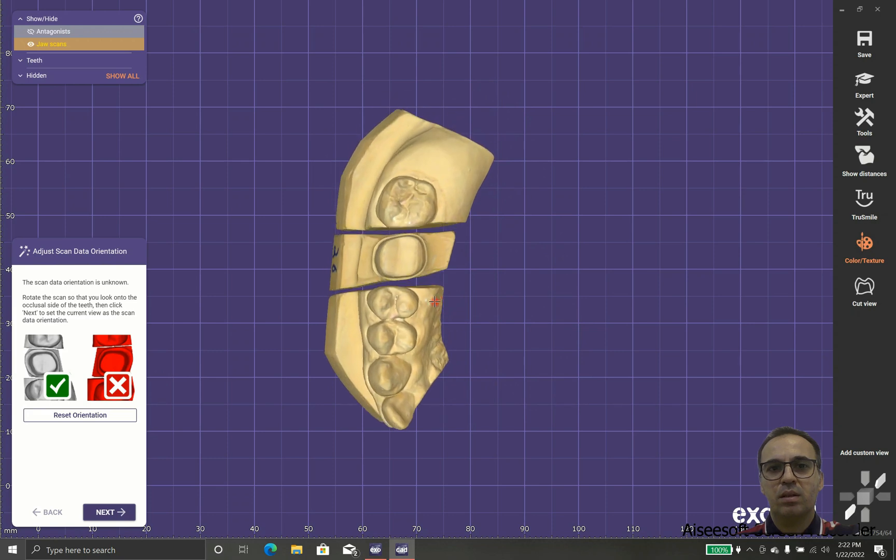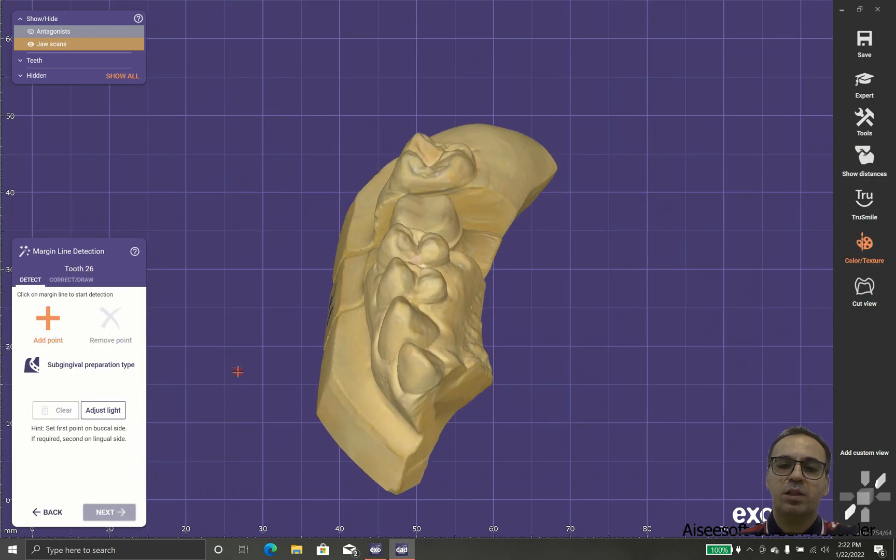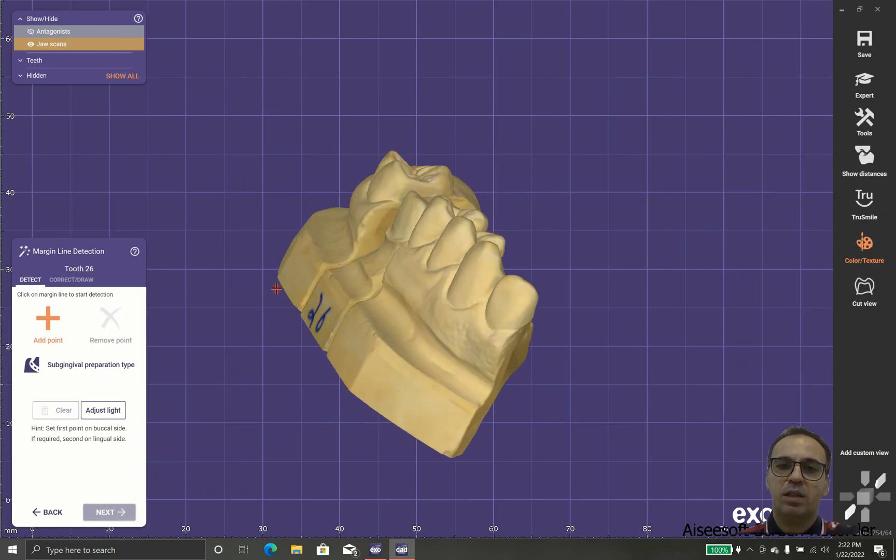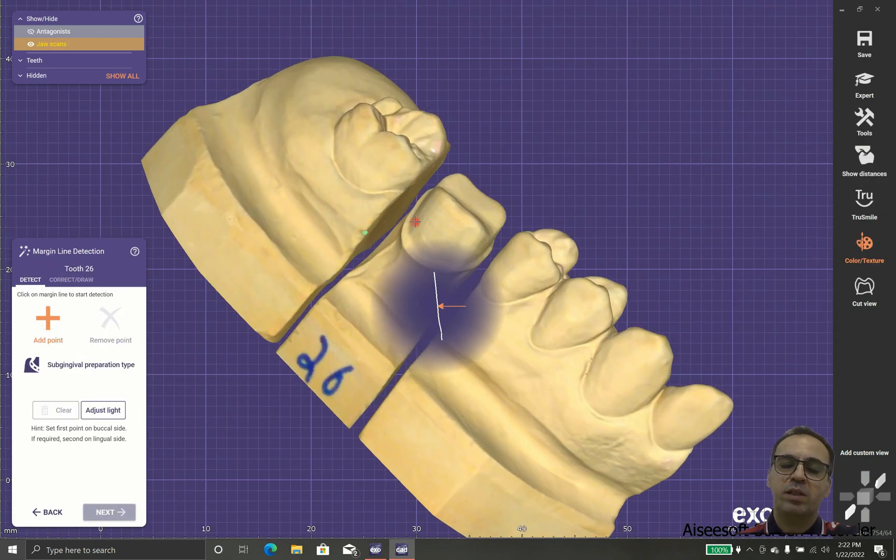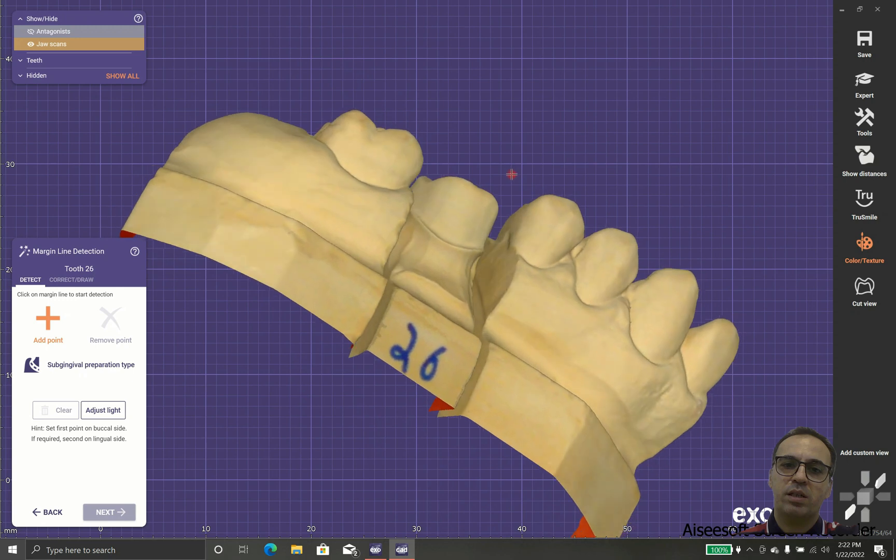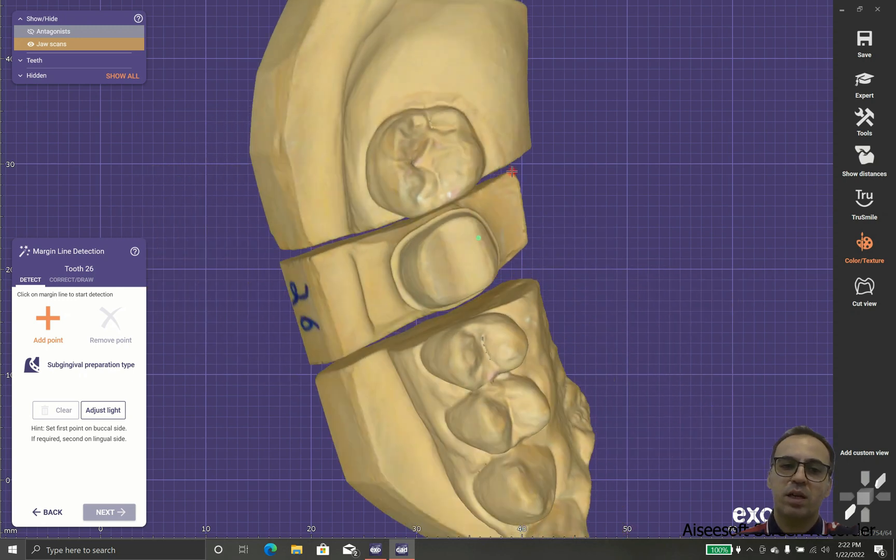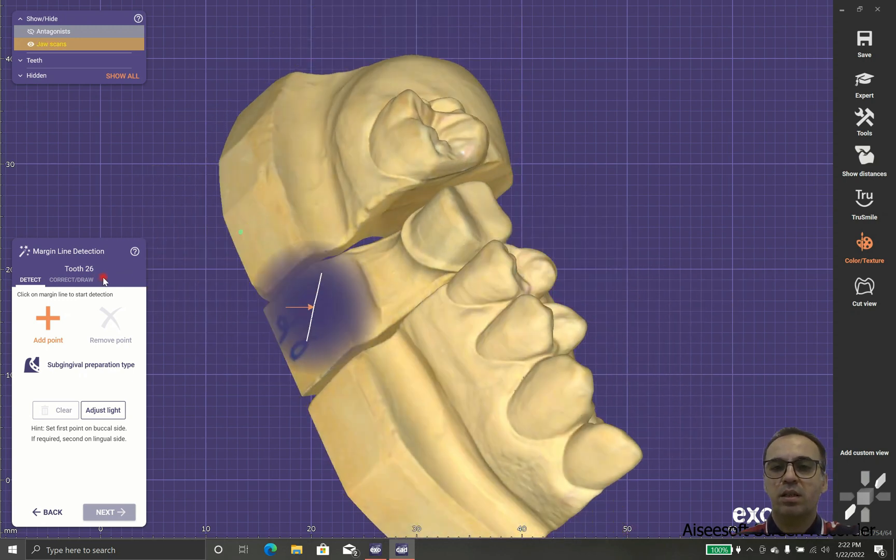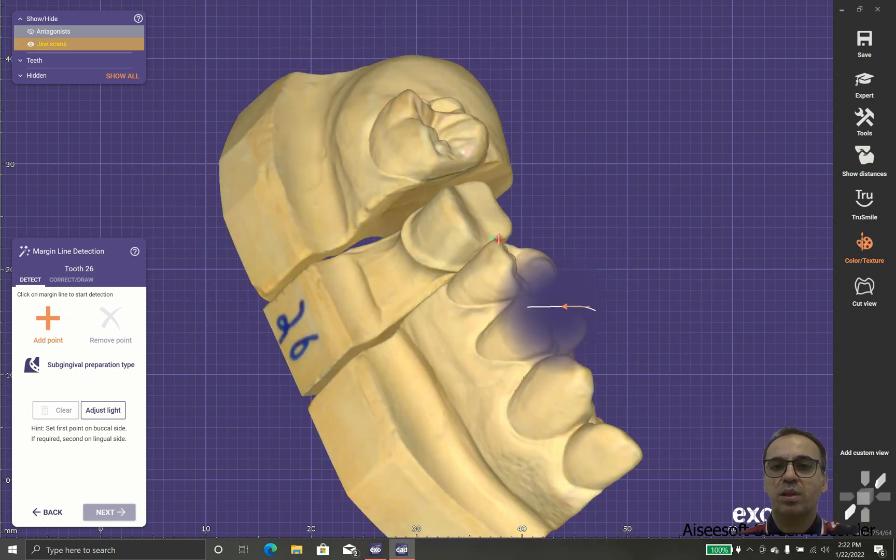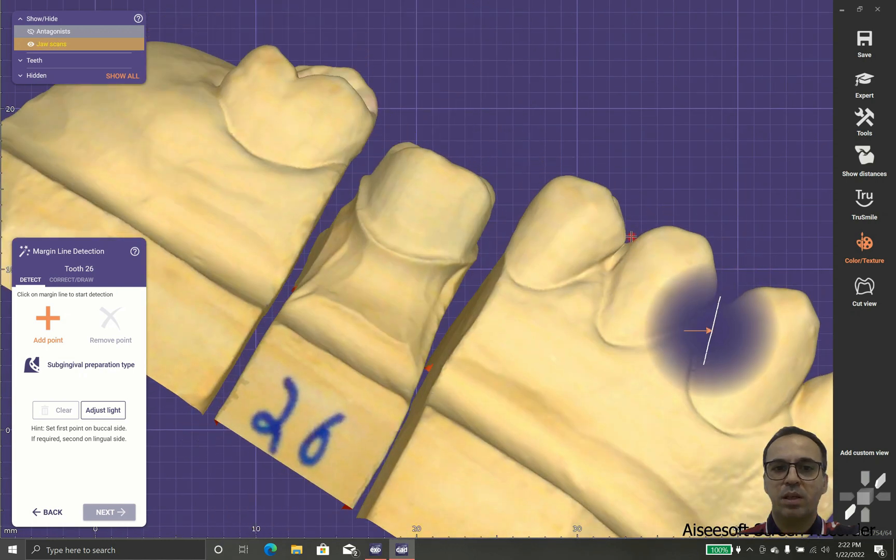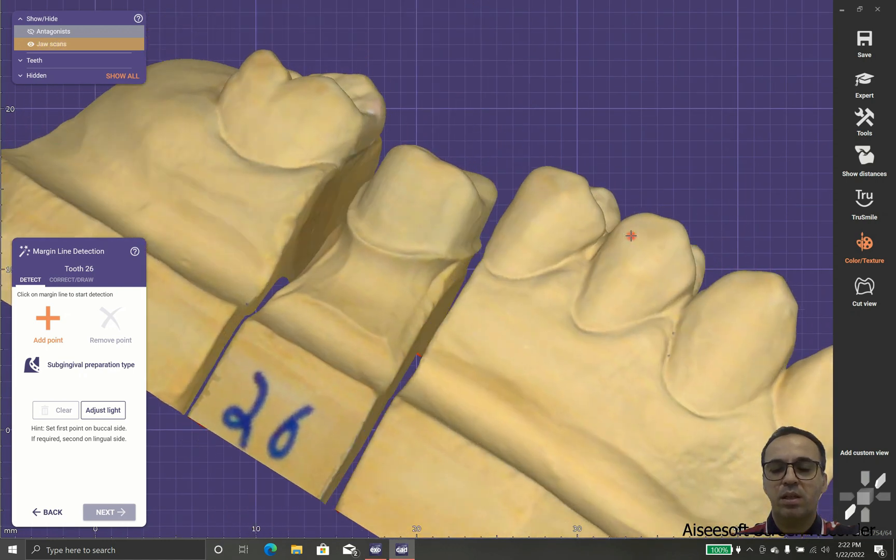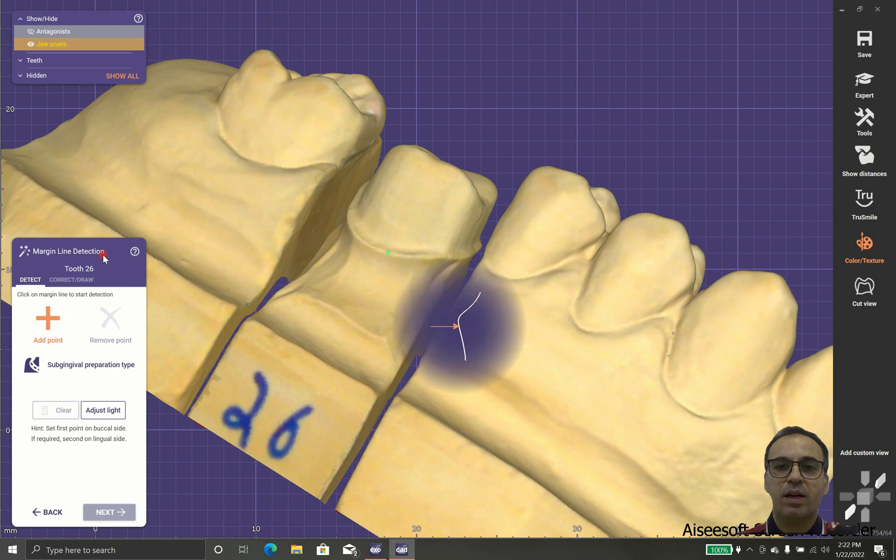Good, as you can see the software shows us the normals. The normals means which side is inside and which side is outside, and we should point to the outside.